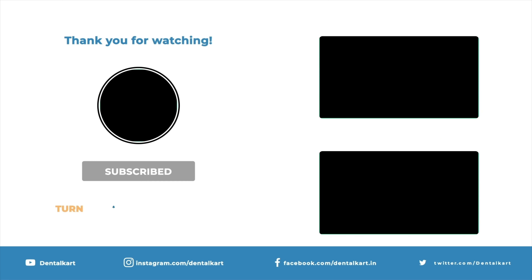Coming to the mandibular forceps of the kit: mandibular anterior forceps have a vertical hinge with beaks positioned at a 90-degree angle to the handle. The beaks are identical, short, and close, with smooth and concave surfaces. This design allows for the smooth extraction of the six anterior mandibular teeth from canine to canine.